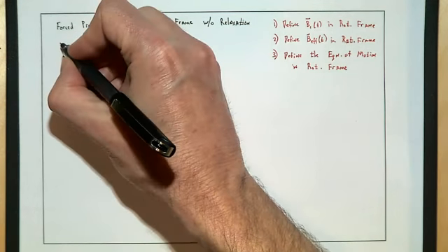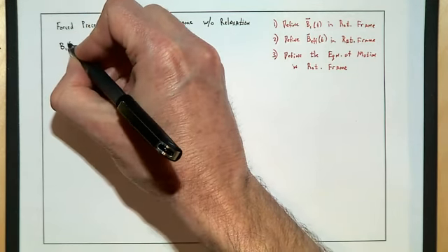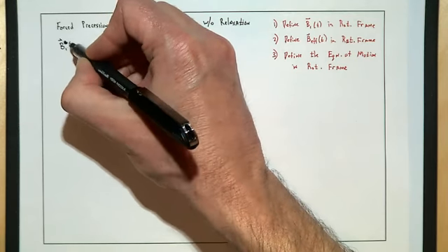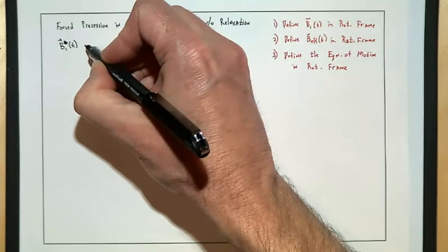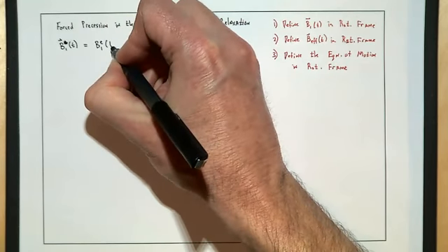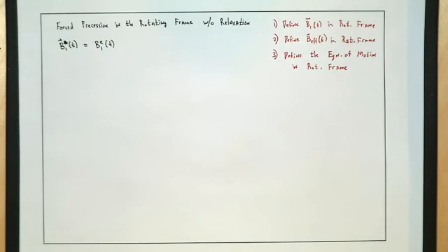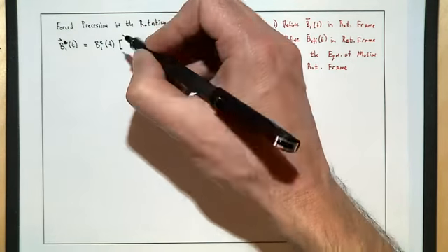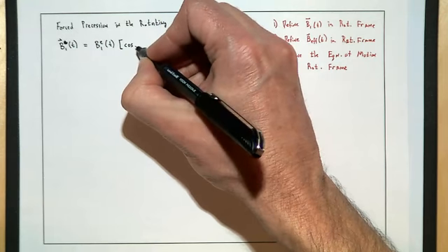So earlier on in this lecture, we gave a description of my B1 field itself. My B1 field as a function of time depended on some B1 envelope function. That could be that Rect function or Sinc function or many other things, as it turns out. And that was just operating on top of a cosine and a sine term.